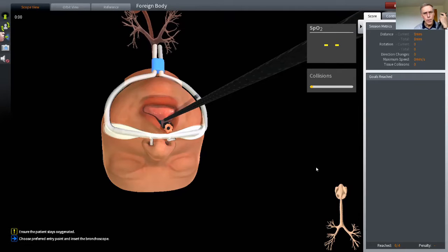To avoid trauma, we have already discussed the options of airway management, but I'm going to use the flexible bronchoscope for intubation. And this is, in my view, probably the ideal instrument because it's small, it's very versatile and mobile. You can navigate easily, and it's relatively atraumatic. This child would have been anesthetized with total intravenous anesthesia, and also local anesthetic has been sprayed with an aerosol technique. So I'm going to start with an oral intubation.